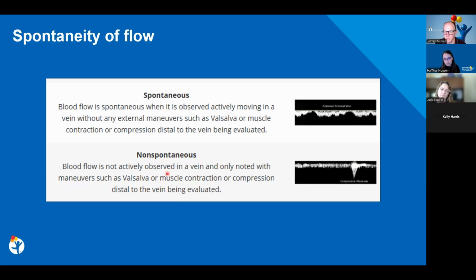So yeah, we do that, but we do not go down to the calf veins. Yeah, we're the same. One of the arguments against it was the sonographers told me that doing those augmentation maneuvers, like we were talking about with MSK injuries, is pretty hard on them. So we have taken it away. I'm not sure we've lost much from it, but yeah.